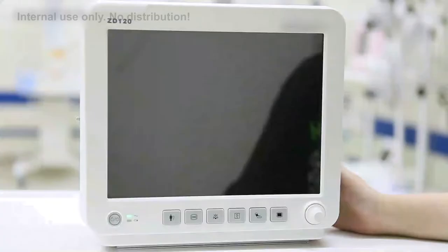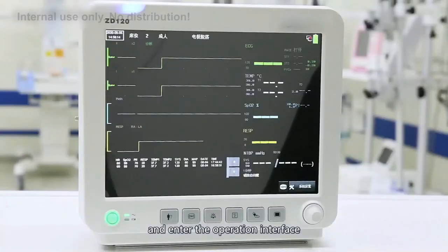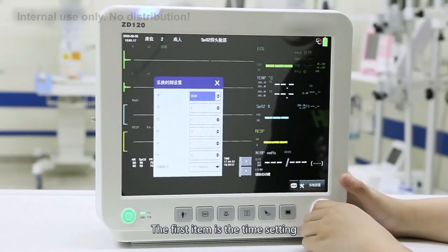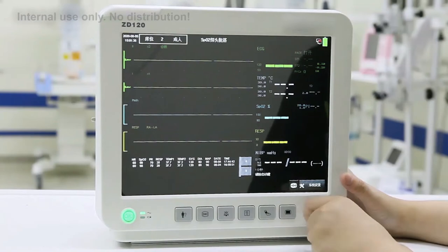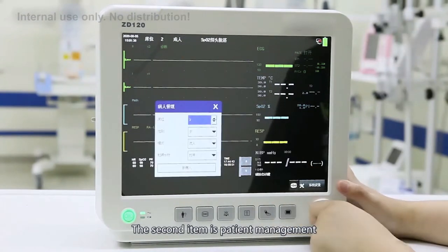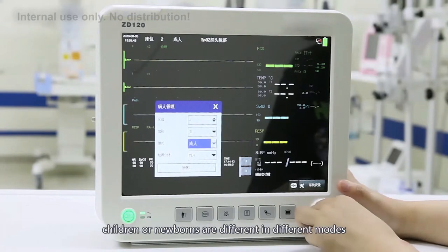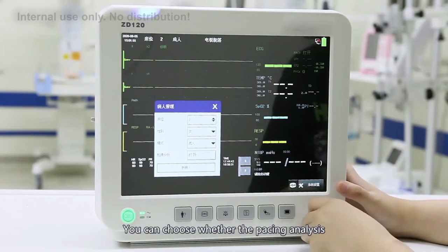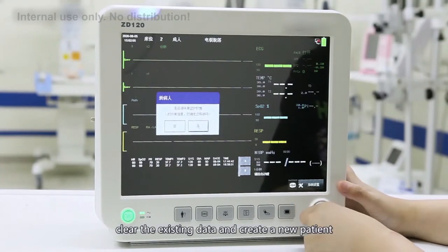Operation introduction. First, long-press the power button for 3 seconds to start the monitor and enter the operation interface. At the top left is the status bar. The first item is the time setting — click the shuttle button to set the current year, month, day, and time. The second item is patient management, where patient information can be set. The default alarm limits for adults, children, or newborns differ by mode. You can toggle the patient analysis function, clear existing data, and create a new patient.